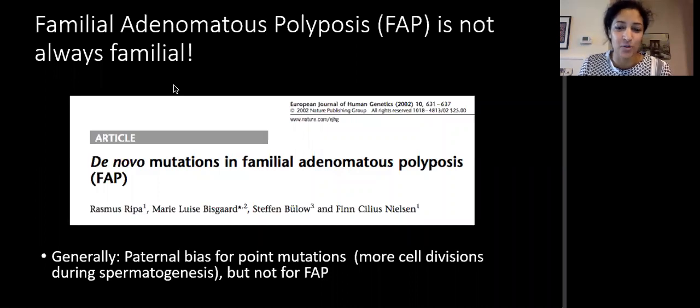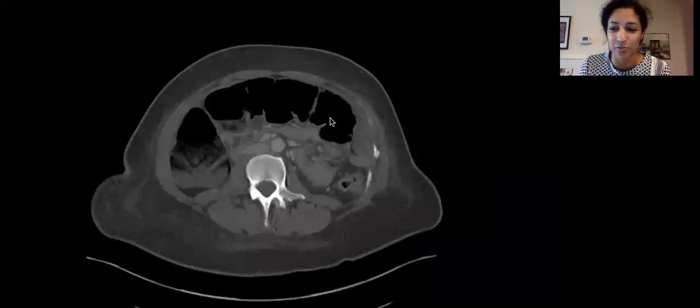And if you want to be extremely careful, you should look at the lung windows on your colon, and you might be able to see these very subtle multiple nodules or polyps in the colon.